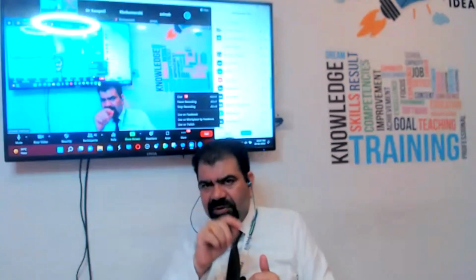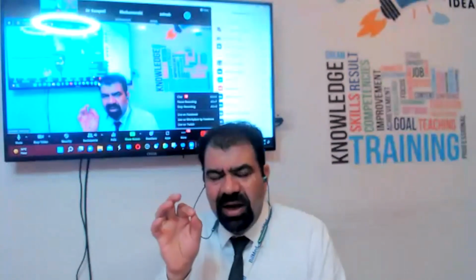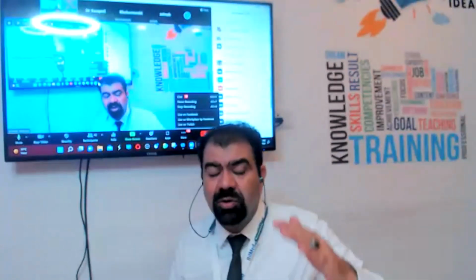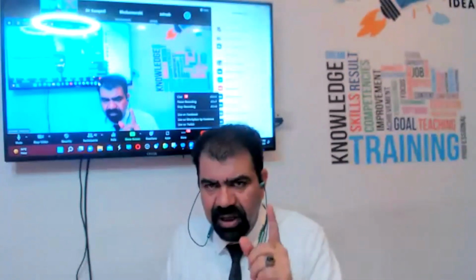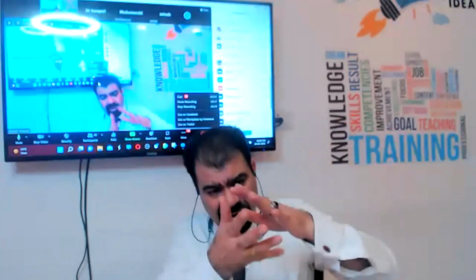Now, all of a sudden, you are seeing a thick endometrium. In that particular case, whatever we are discussing, everything is expelled out. Will you expect a 10? No, you will not expect. So the point is, try to understand, if the endometrium is thick, it is not actually the endometrium which is thick. It is something in the endometrium which is making it thick.